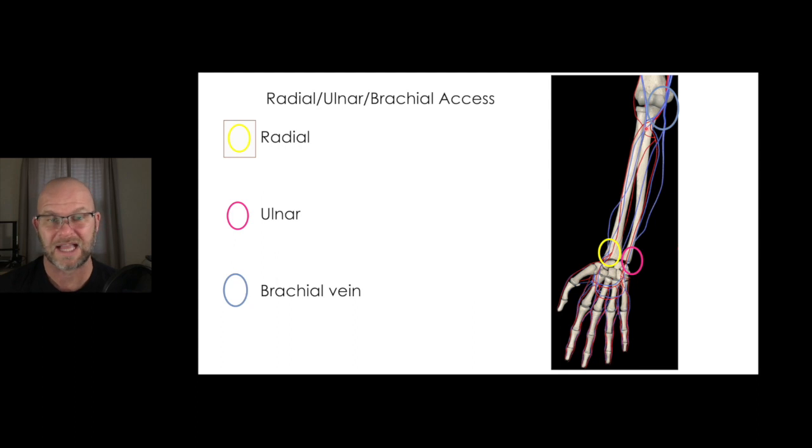Versed will help relax the patient and help break that spasm. You can also put a blood pressure cuff on that same arm and blow it up, leave it up for a few minutes, and that will cause the artery to dilate and release that catheter. It's pretty rare that this complication happens. It's more painful than dangerous, but once that's out, all that pain goes away.